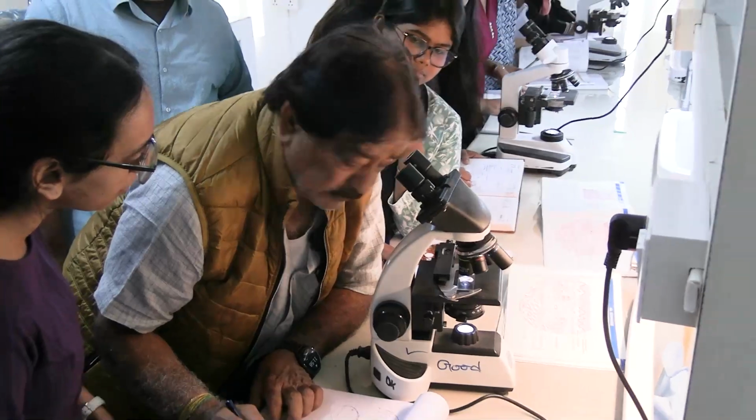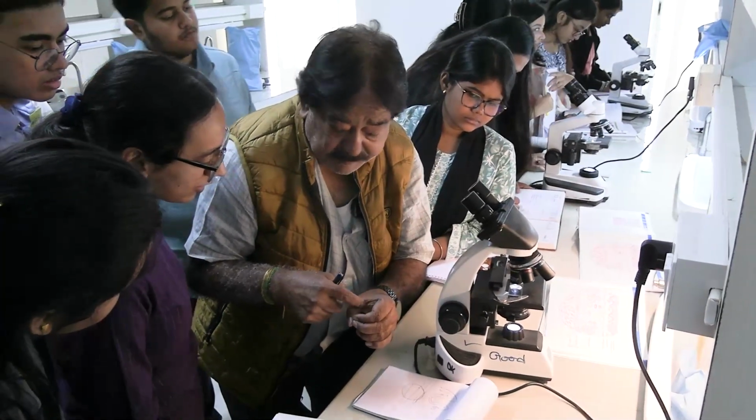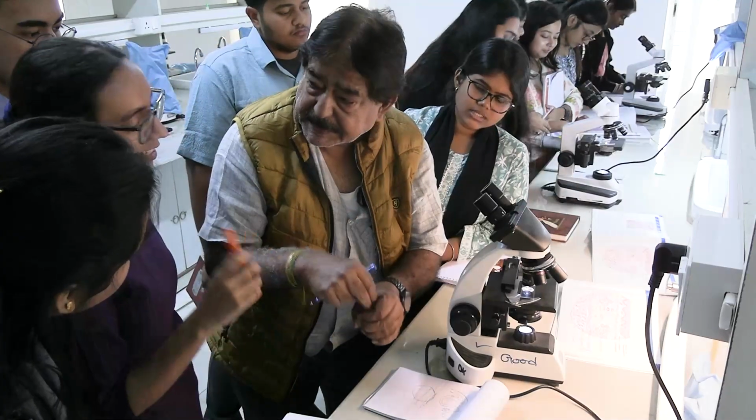This white, yes sir, this is the inner layer. This is epithelium. The food will pass through here. This is the food passage.